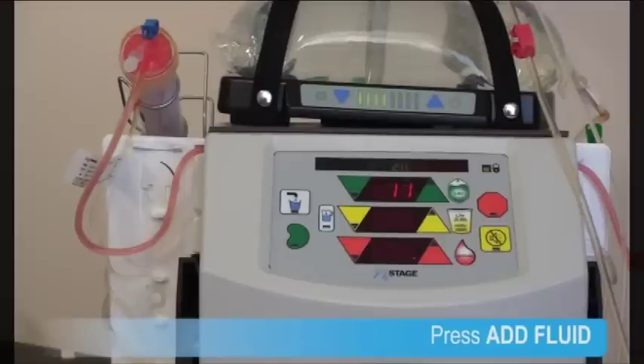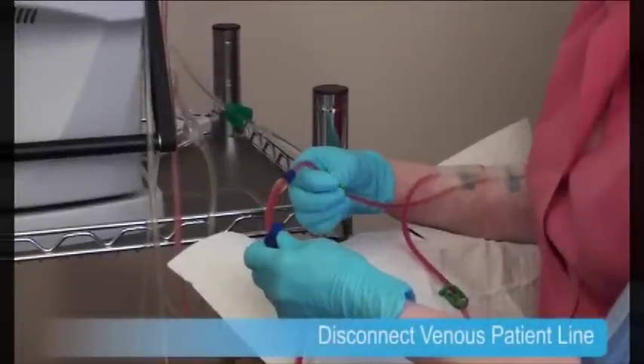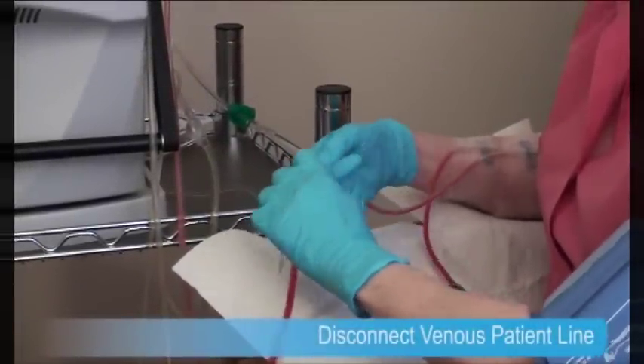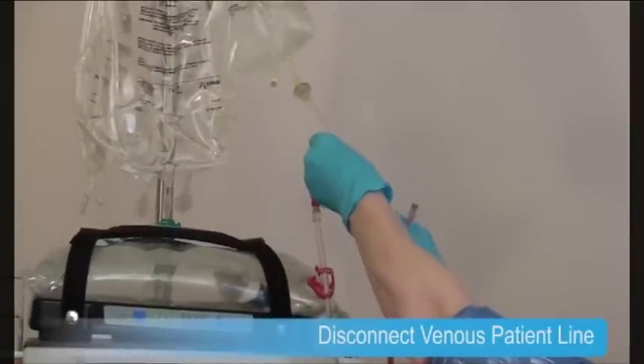She knows that it's okay if her lines are tinged pink slightly, as it represents a very small amount of blood. She takes her blood pressure and pulse rate and records them. Lois can now clamp her venous patient line and disconnect it from her venous vascular access. She connects the venous patient line to the priming spike.